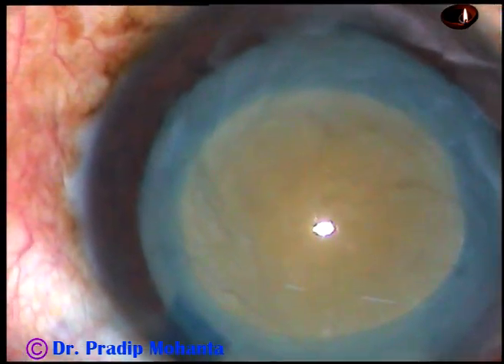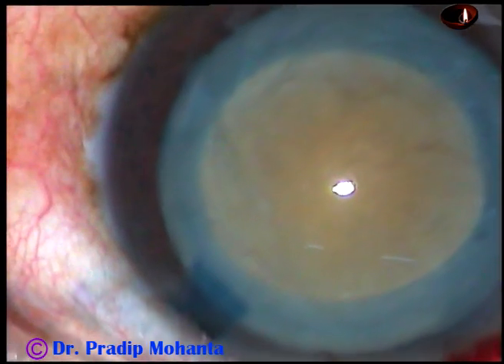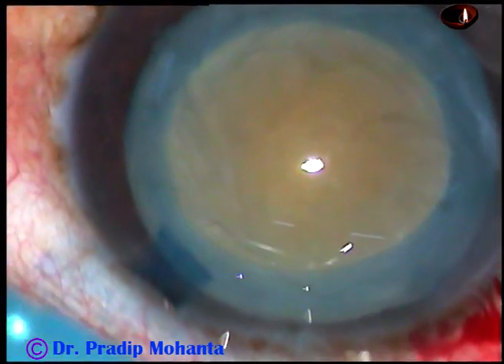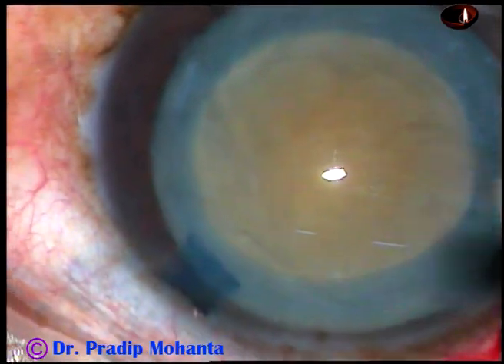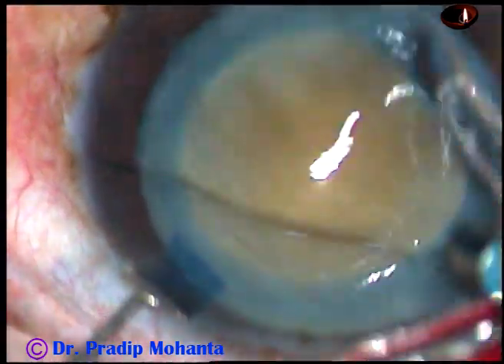And now this nucleus is free-floating. I have a plan in such cases — I am going to use a technique which may be called the tunnel, engage and chop technique.